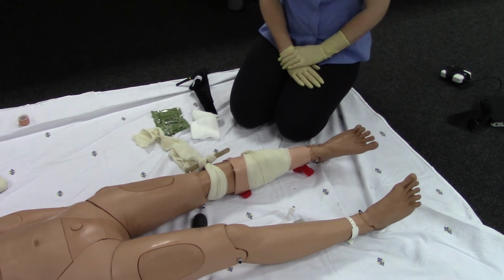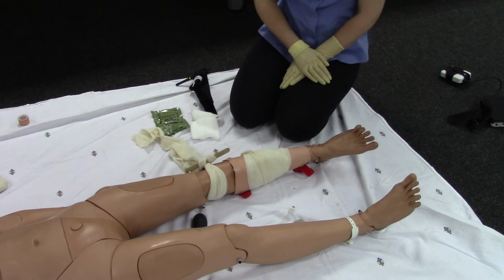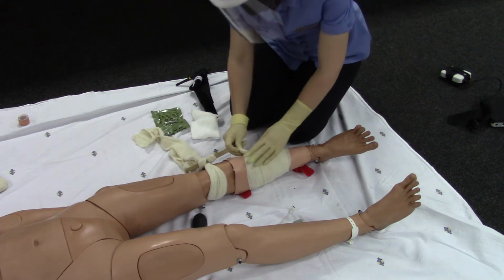Step 7. Use of topical hemostatic agent if tourniquet ineffective. Uncontrolled bleeding with tourniquet and/or direct pressure, or bleeding in an area where a tourniquet cannot be applied. Apply hemostatic agent directly to the source of bleeding.